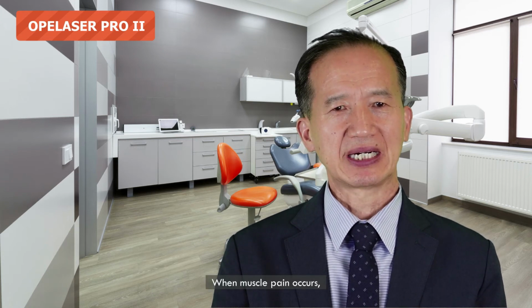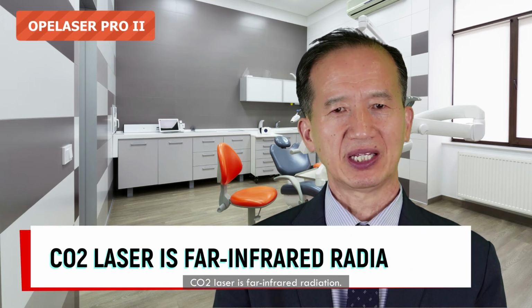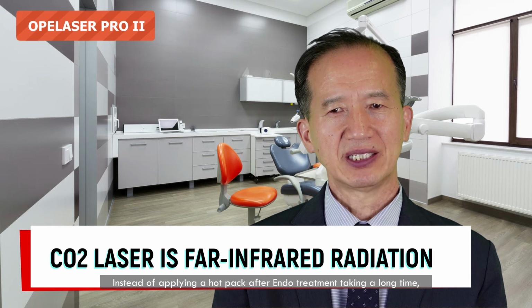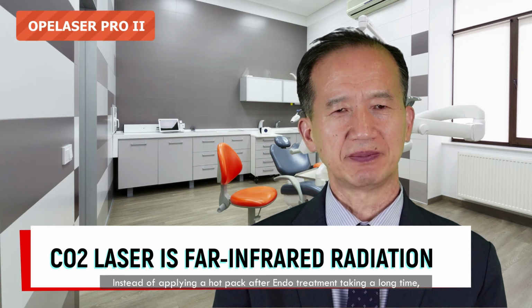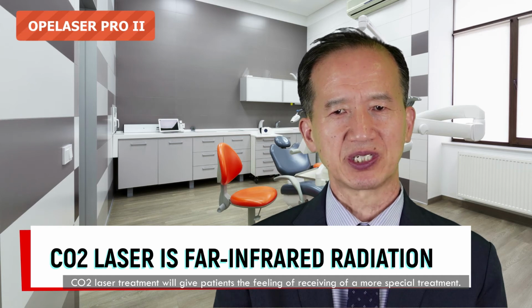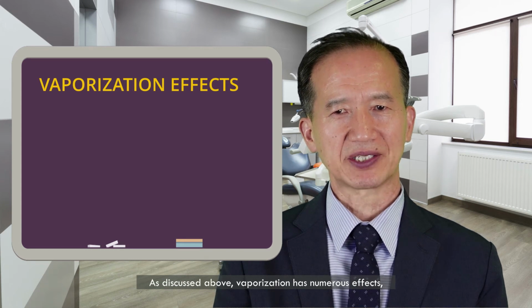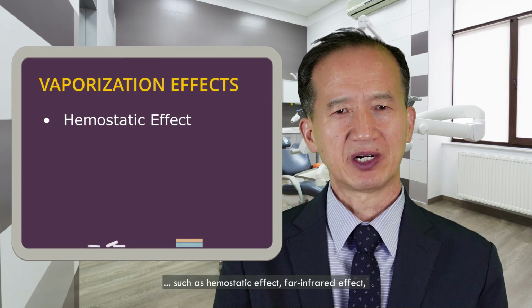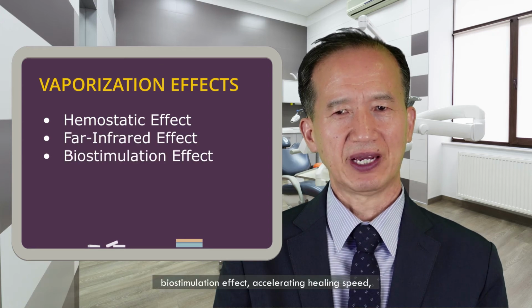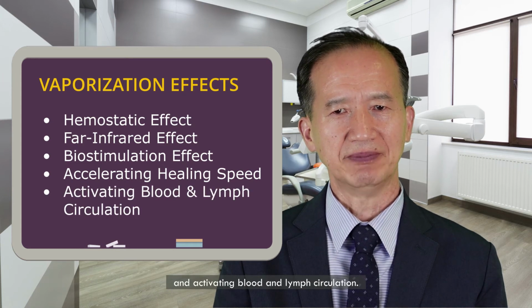When muscle pain occurs, far infrared treatment is performed with a hot pack. CO2 laser is far infrared radiation. Instead of applying a hot pack after endo treatment taking a long time, CO2 laser treatment will give patients the feeling of receiving a more special treatment. As discussed above, the vaporization has numerous effects such as hemostatic effect, far infrared effect, biostimulation effect, accelerating healing speed, and activating blood and lymph circulation.